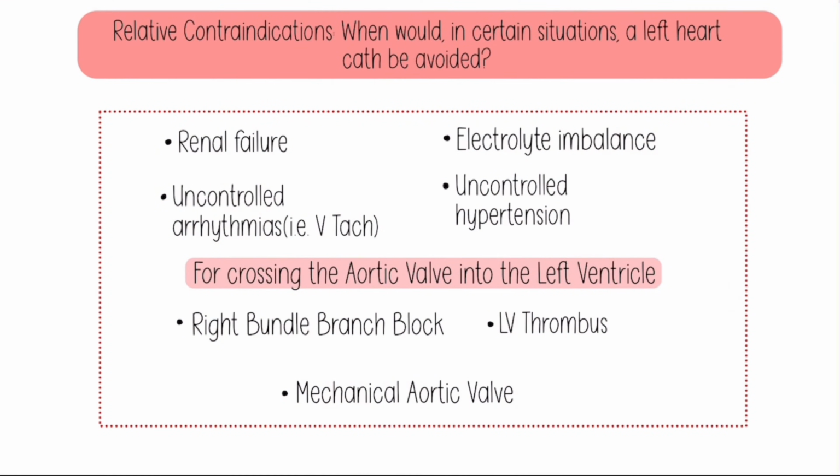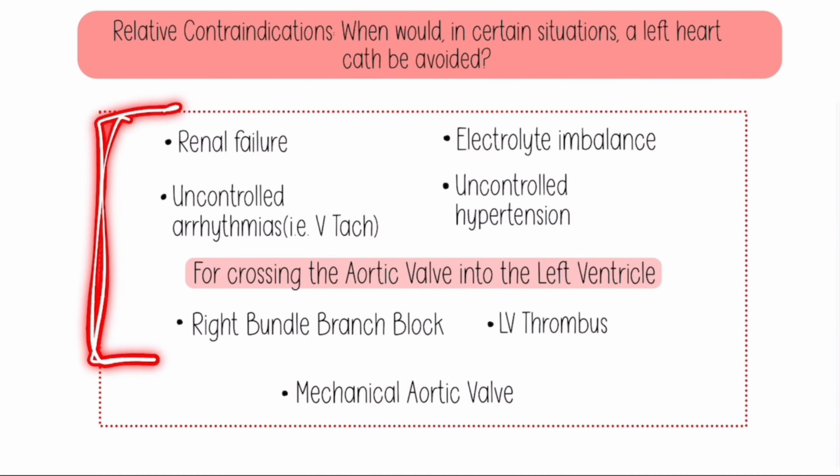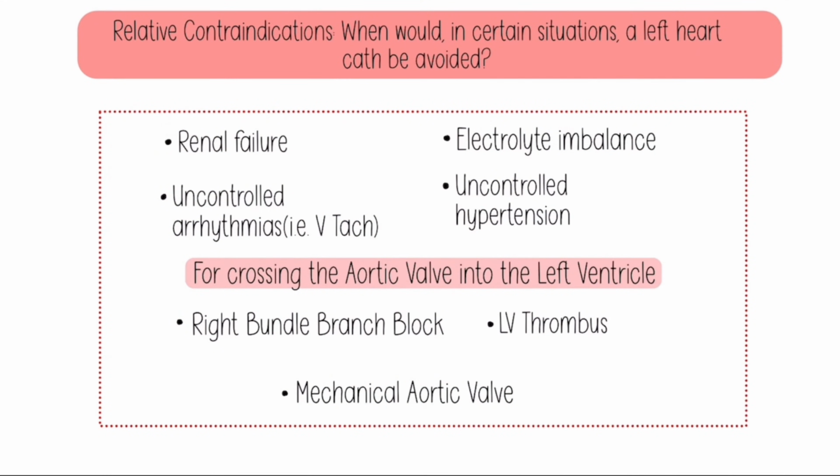Now, relative contraindications. When would, in certain situations, a left heart cath be avoided? And I say this because this can kind of be subjective. Remember that patient I talked about, if you have had an event in the past, but you don't fit the normal category of everybody else, that doesn't just mean that you get ignored, right? Some of those patients will opt for some type of invasive test to rule out anything serious going on. So I say all of this too because some of these are going to be reasons for the patient needing to have this done, and we'll talk about this in a second.